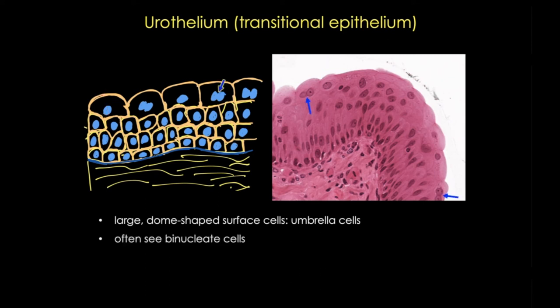Another key feature is that these cells are often binucleate — compare that to the most apical layer in stratified squamous epithelium, which lacks nuclei. Urothelial cells are usually cuboidal or even columnar, and because of these shapes they are sometimes mistaken for a pseudostratified tissue, but it's important to note that only the bottom layer of cells touches the basement membrane. In contrast, stratified squamous epithelia never contain columnar cells.